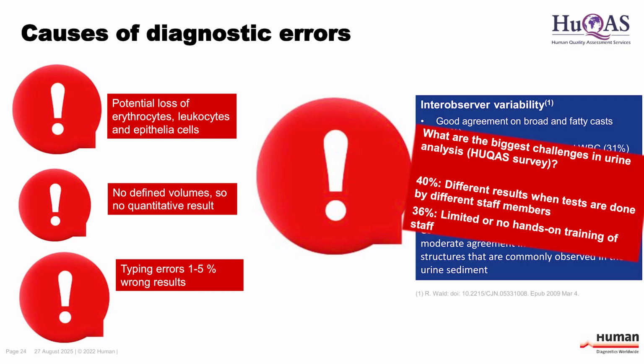We have to consider many issues in urine diagnostic. I mentioned this is my topic, that standardization is the weak point in urine diagnostic, even though it's one of the most common, the most used diagnoses in every lab, in every hospital. The centrifugation step, which we need only for the microscope to have a concentrate, will lose many cells, because it will destroy white blood cells, casts, and crystals, okay? About 20 to 80% of the epithelial cells get lost.